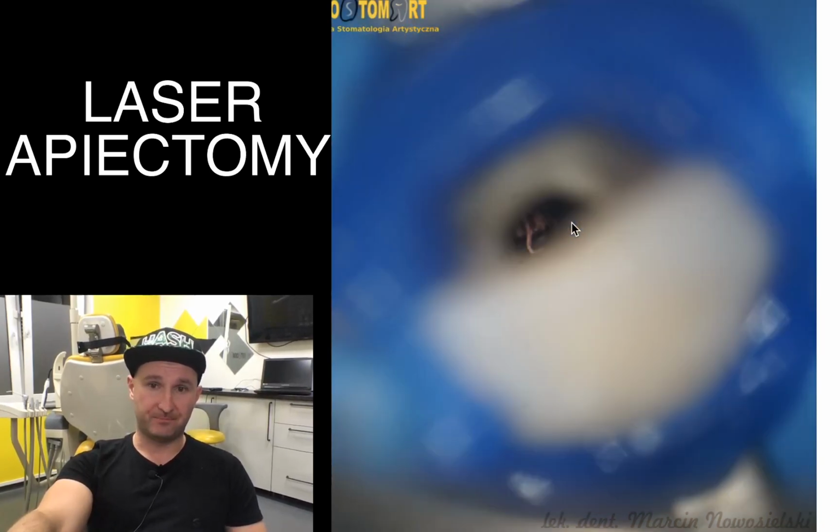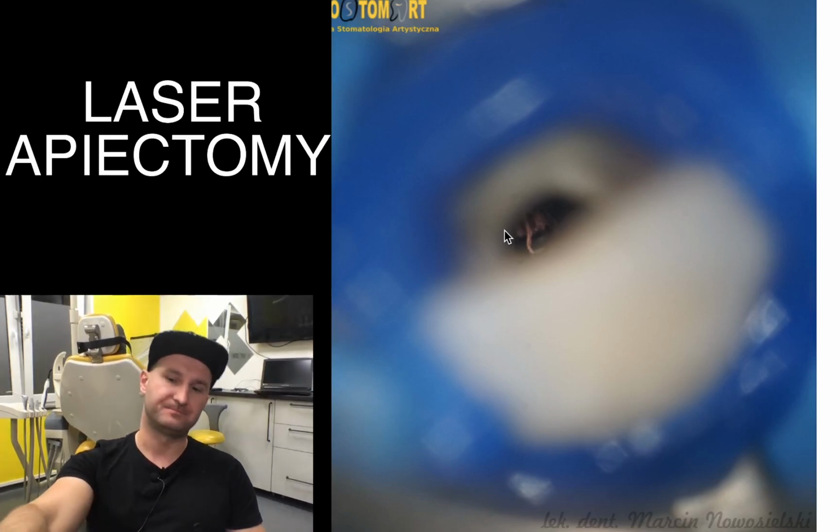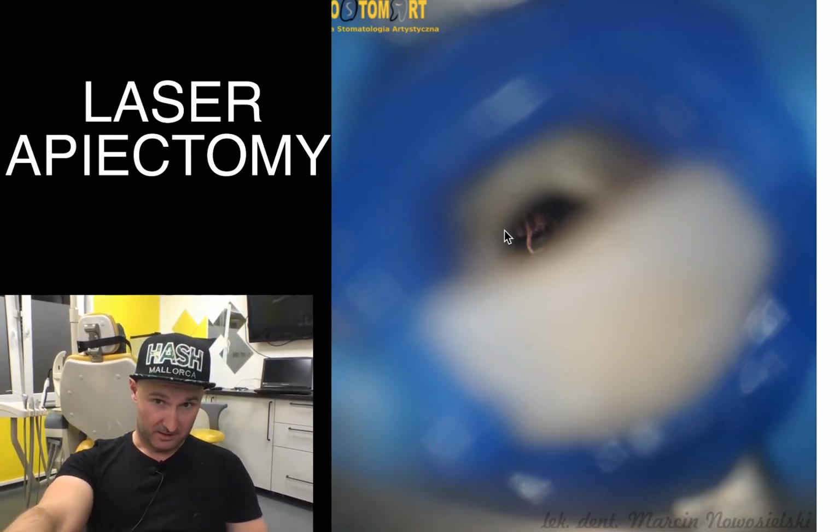As you can see, unfortunately we were not able to remove gutta percha from outside of the apex, so the scenario of doing apiectomy became reality. But we had to finish the root canal treatment first.